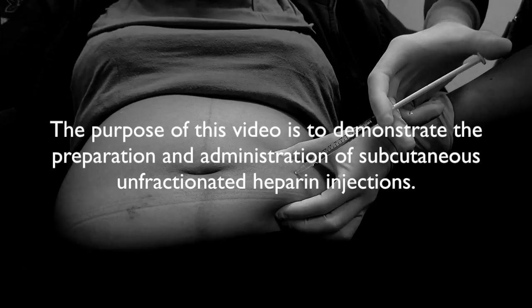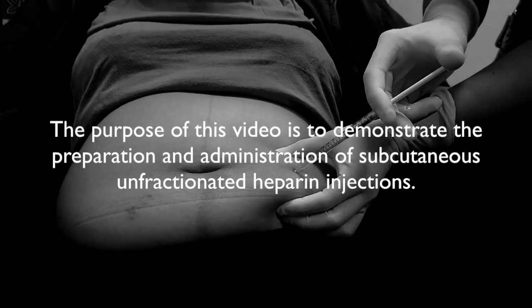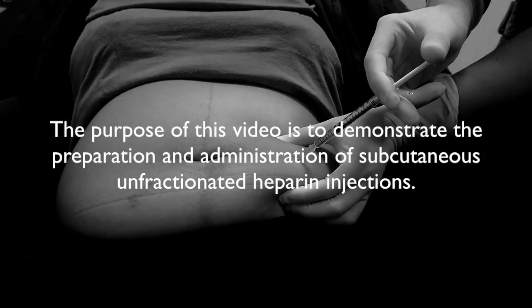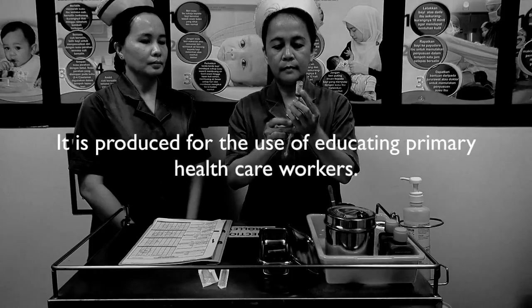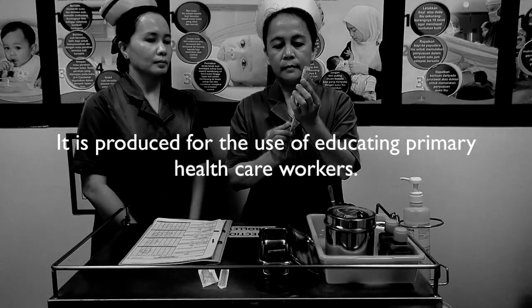This video is for educational purposes only. The purpose of this video is to demonstrate the preparation and administration of subcutaneous unfractionated heparin injections. It is produced for the use of educating primary healthcare workers.